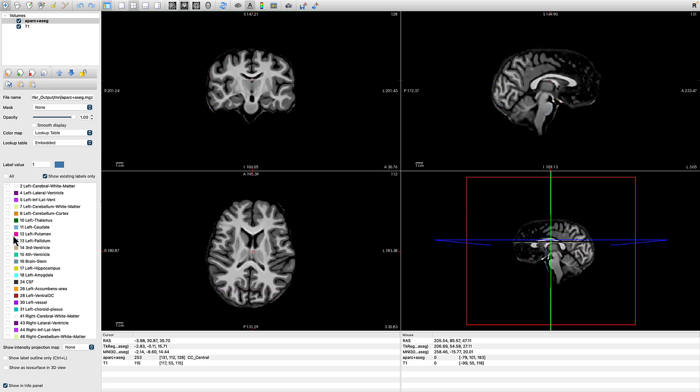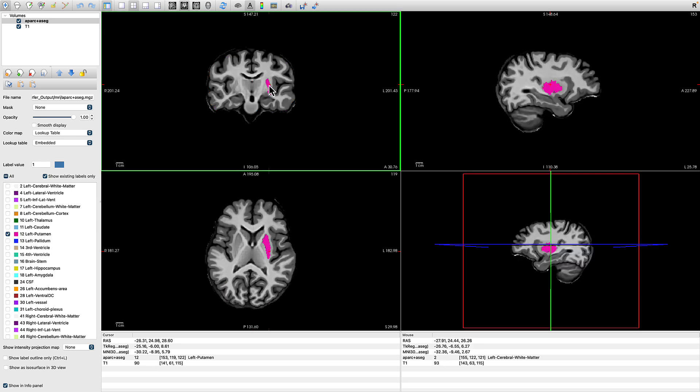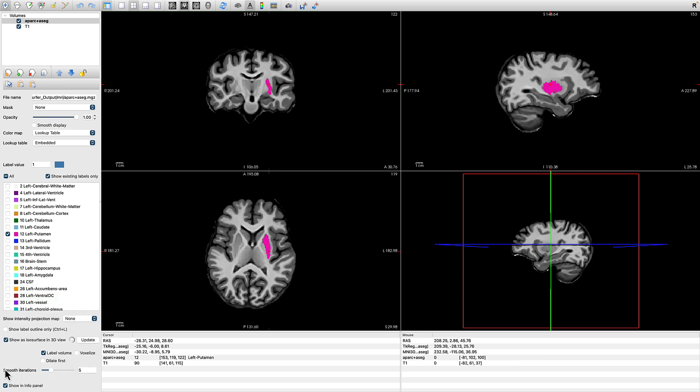I'm going to focus here on just one structure, the left putamen. Keep in mind, FreeSurfer's orientation, right is on the left, left is on the right. And I'm going to click on Show as ISO surface in 3D view to give you a better sense of where exactly this structure is located.